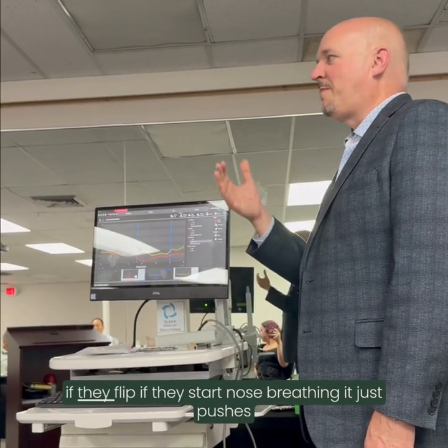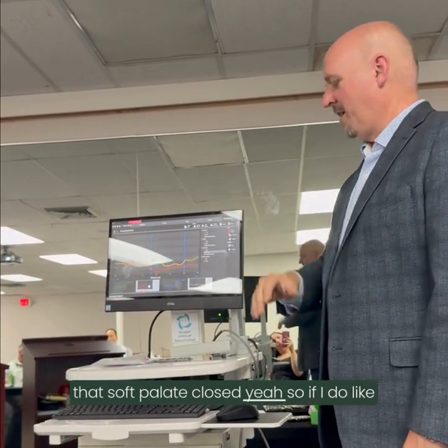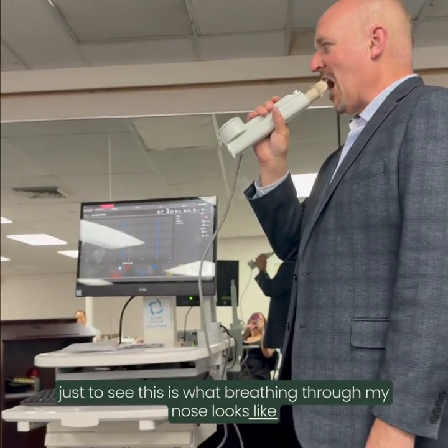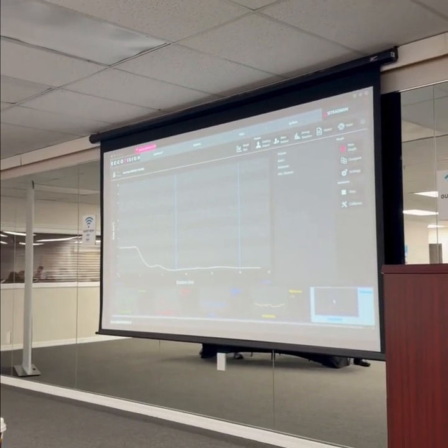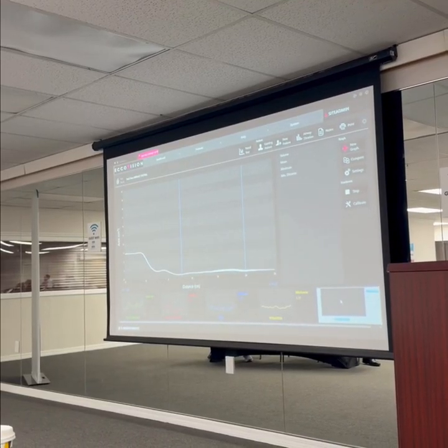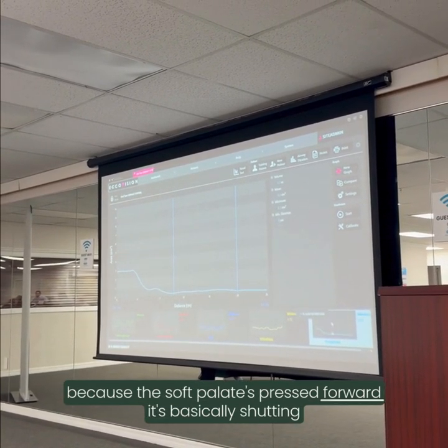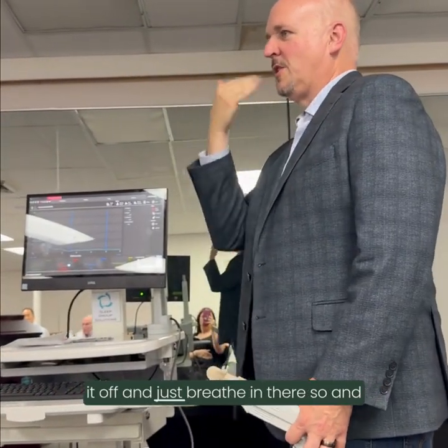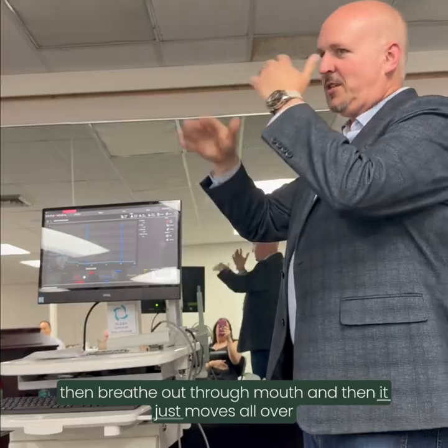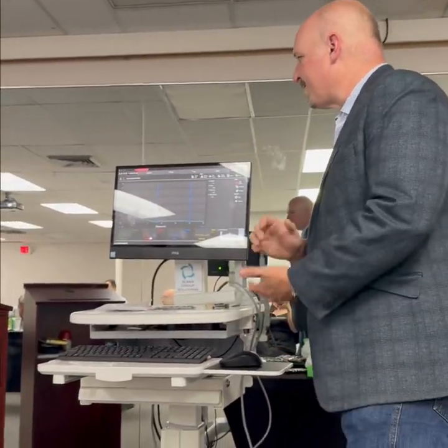Because if they start nose breathing, it just pushes that soft palate closed. Just to see, this is what breathing through my nose looks like. With nose breathing, you see a flat line basically, because the soft palate's pressed forward, it's basically shutting it off, and you're just breathing there. What you'll have people do is breathe in and then breathe out through their mouth, and then it just moves all over. So yeah, pinch your nose, breathe normal through your mouth.